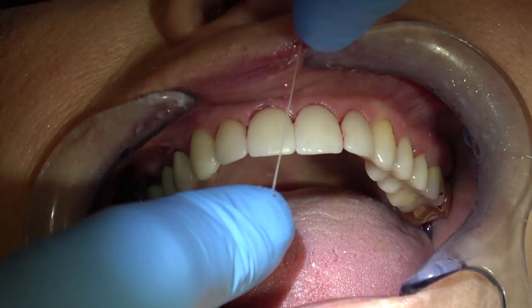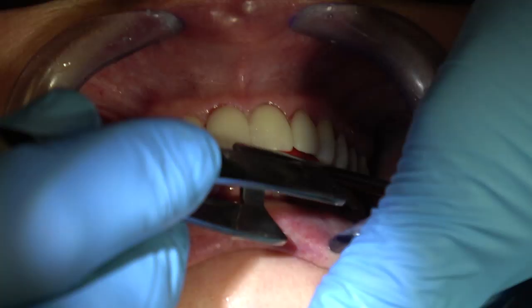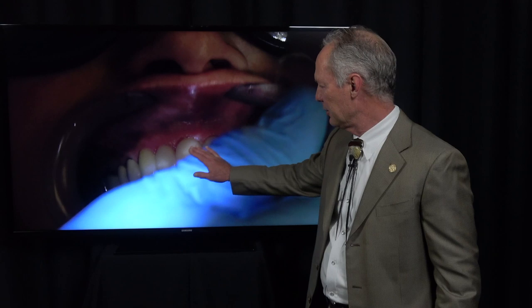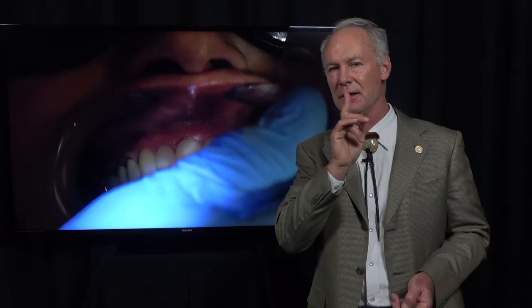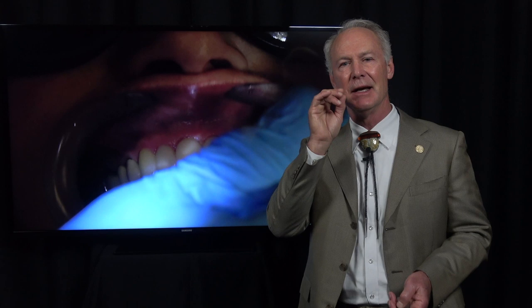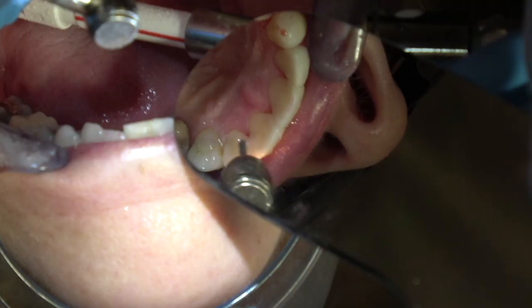Now they're completely cured, so you don't have to worry about flossing. Then check with articulating paper. Remember, it's very important that the front teeth don't hit first. You want the contacts to be from cuspid to mesial of first molar. Watch the Dentistry Masterclass's video on occlusion. You don't want the anterior teeth, the four anterior teeth, to contact. You want them to be slightly out of occlusion, about one shim stock thickness, so it doesn't distalize the condyle.